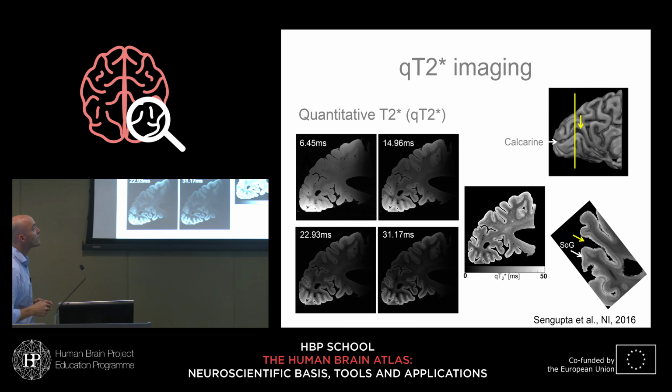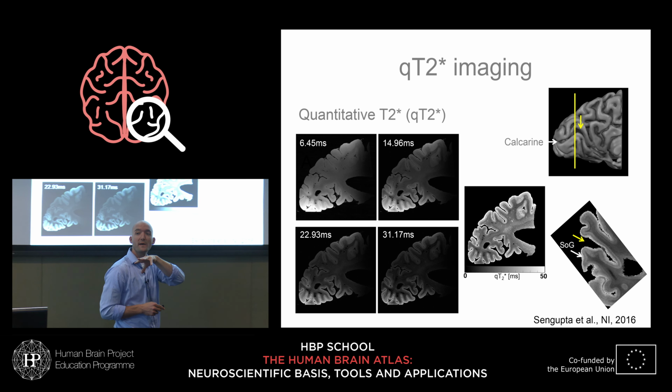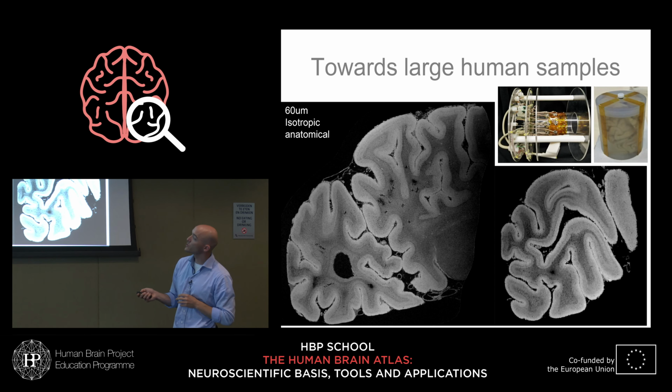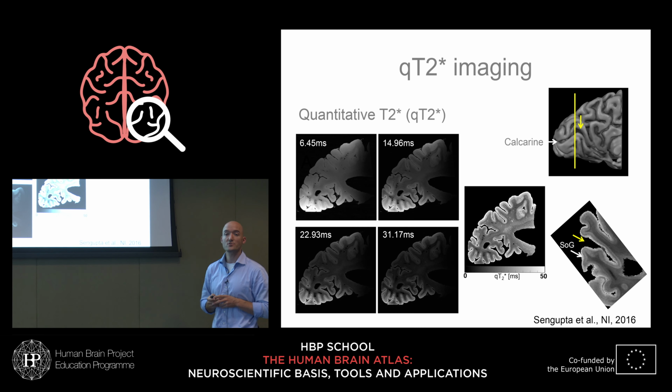But of course, you want to take that onwards to diffusion imaging. First though, here's the question that you had earlier about the biases. Because now we wanted to answer the question that it looks darker, lighter over here than it looks over here. And this is all down to the fact that this is closer to a coil, which lies here, and this is far away from a coil. And so quantitative imaging is the answer to that.